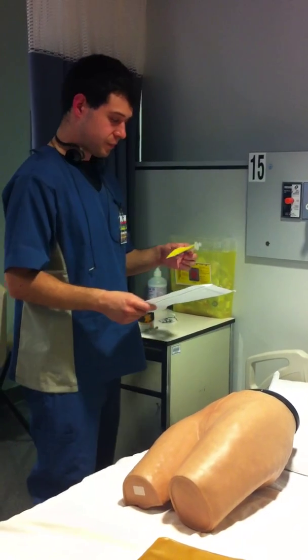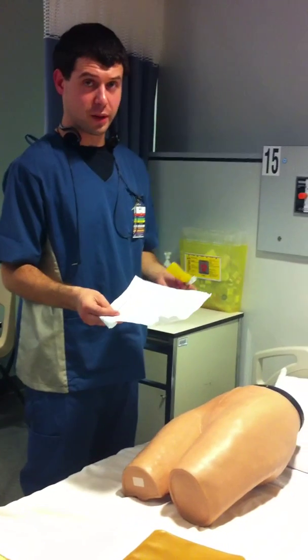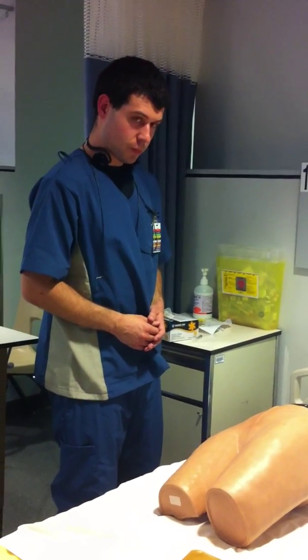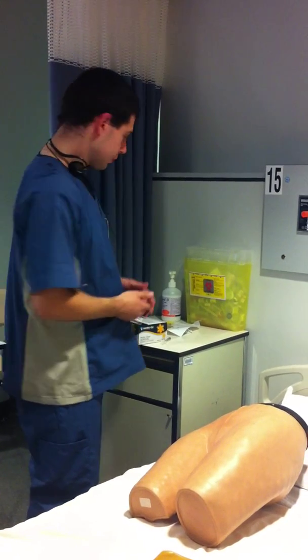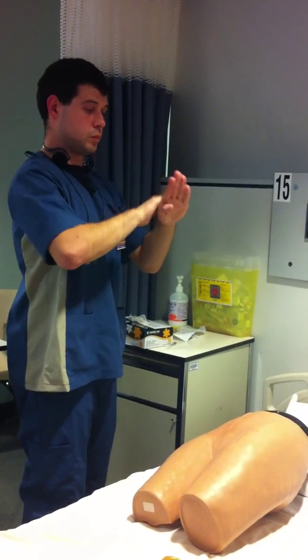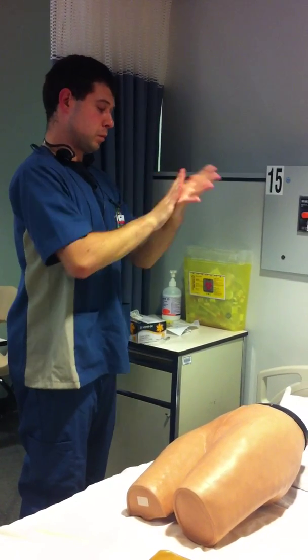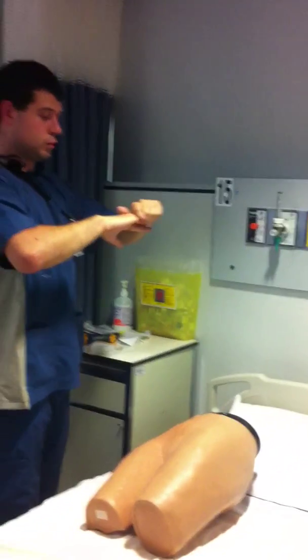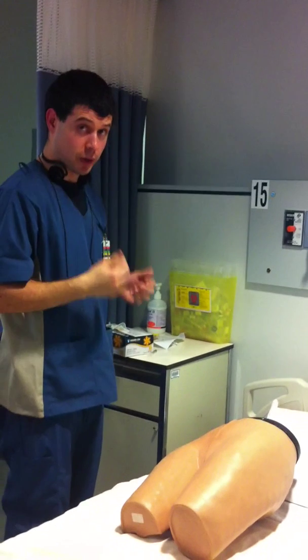I'm going to check my syringe as well, make sure the information is consistent with the MAR. So on the label, 0.5 milliliters, and on the measurement, 0.5 milliliters of Fluvarin, MAR, Fluvarin, 0.5 milliliters. Mr. Tutu, tell me, do you have any allergies? Have you had any seizures? If he has said no, then I can get ready to prepare the medication, to administer the medication. So now I'm going to do hand hygiene. Okay, after I've performed hand hygiene, I can put on some gloves.